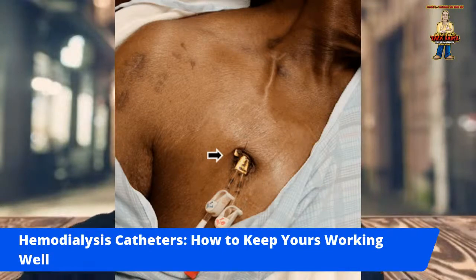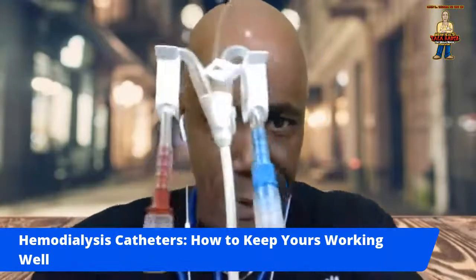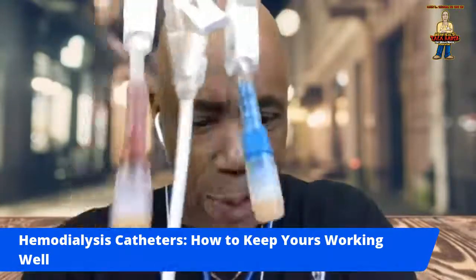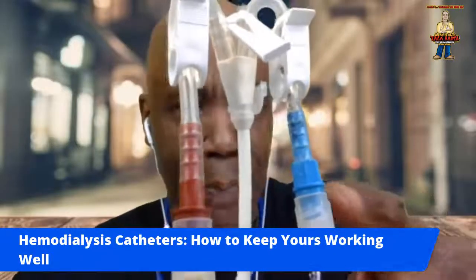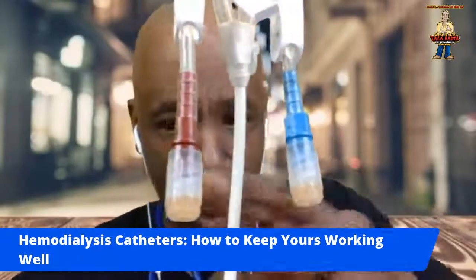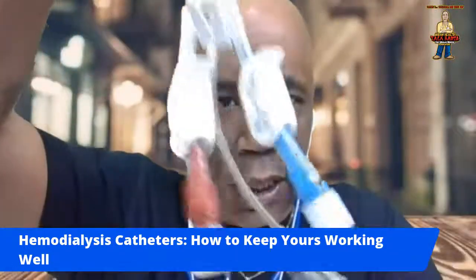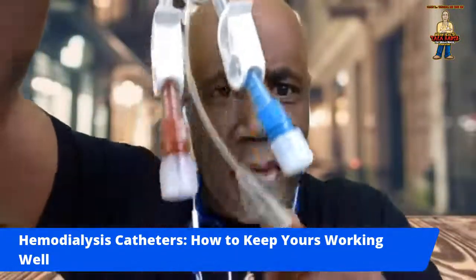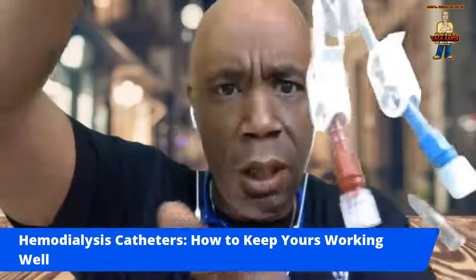All right, let me remove this banner so I can show. Let me show you something, guys. Right here, these caps. Never remove these caps on your catheter. Better yet, let me show you one that you'll be using. Never remove these caps right here. Never take them off, right?